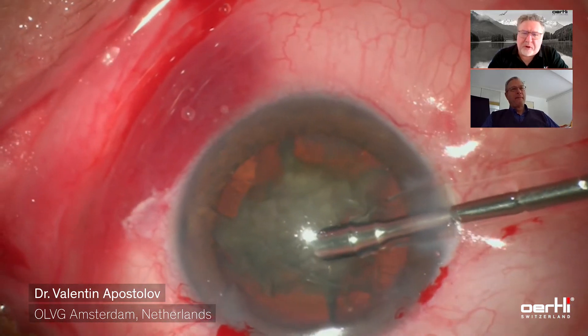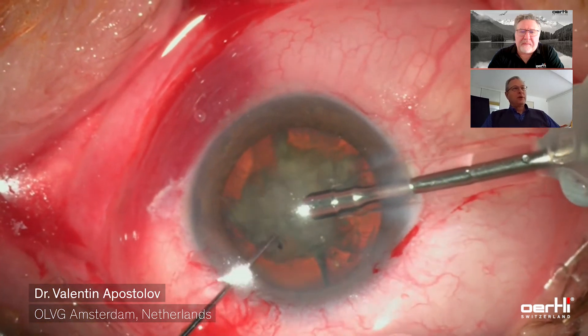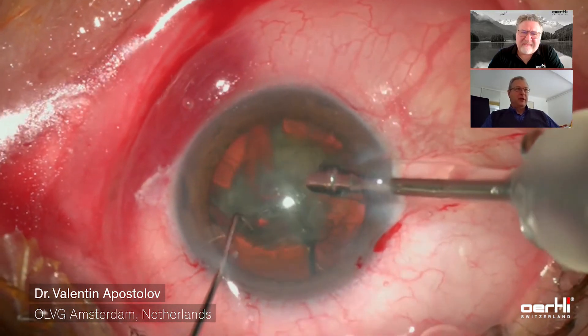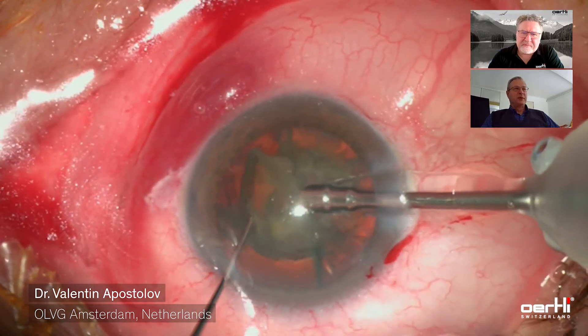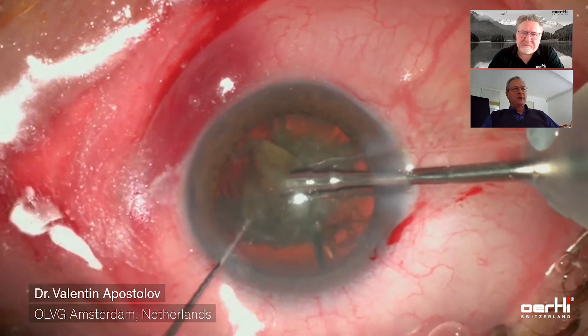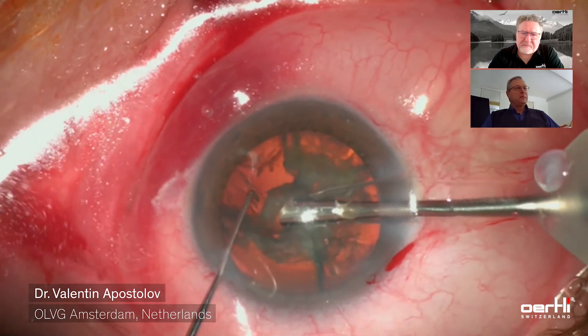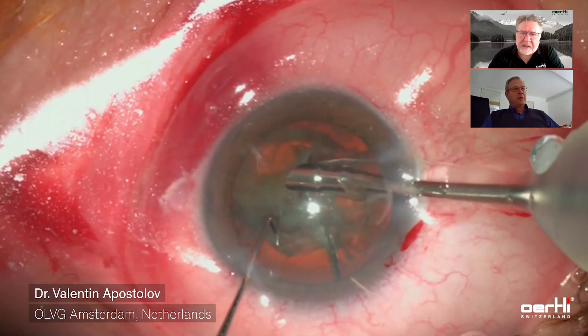Now you're working with a 2.2, 30-degree angle FACO-Easy tip. Is that correct? Yes, that's correct — that's the 2.2 FACO tip. The construction of this tip is quite unique and has several excellent properties. The opening of the FACO tip is quite large, so it has no problems engaging a hard nucleus. It gets the nuclear material into the tip and then all the emulsification goes on within the tip. It also has quite a narrow shaft, and the bore of the shaft is quite small, which helps to prevent post-occlusion surges.